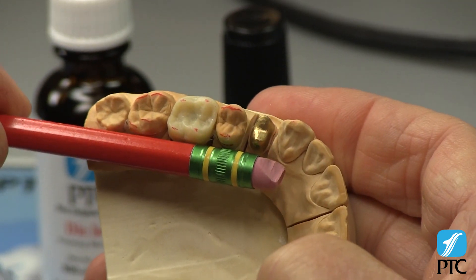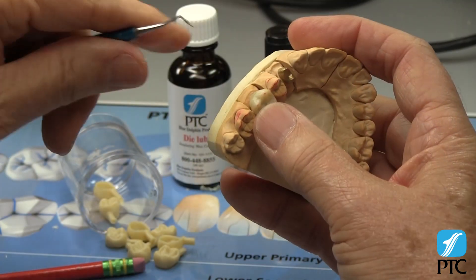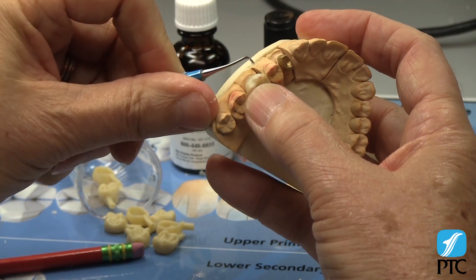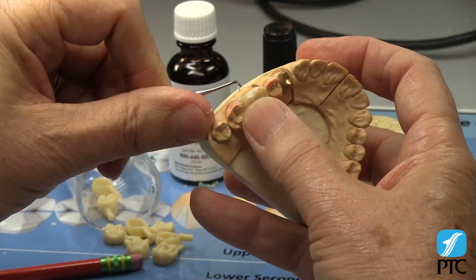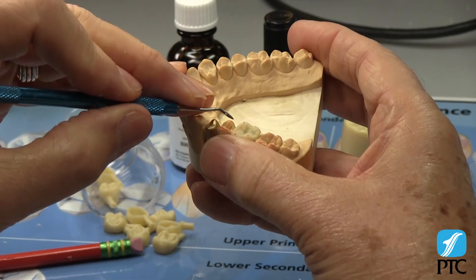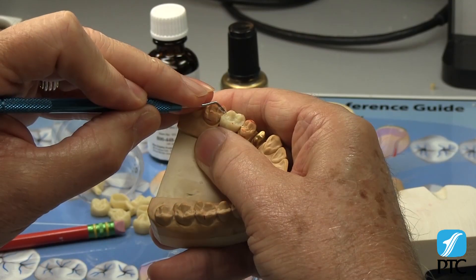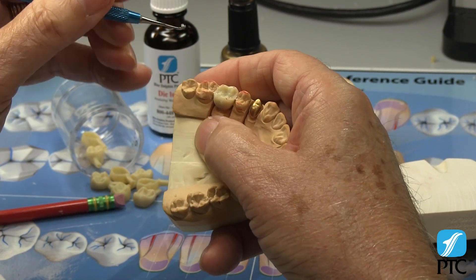Using the buccal heights of contour and the cusp tip marks as a guide, carve the buccal contour. Do the same for the lingual if necessary. If the marginal ridges are slightly high, follow the existing planes on the pattern and reduce them to the height of the adjacent teeth.